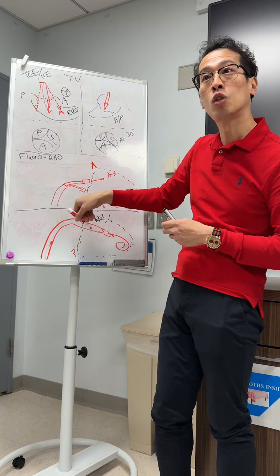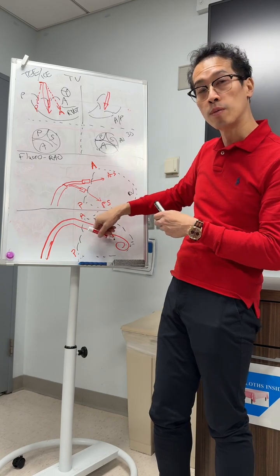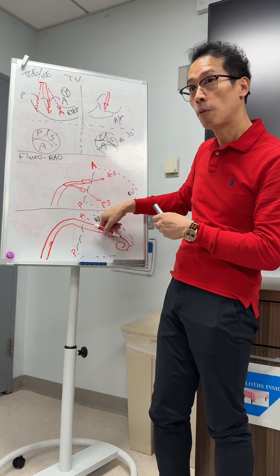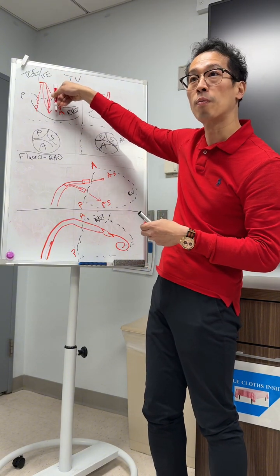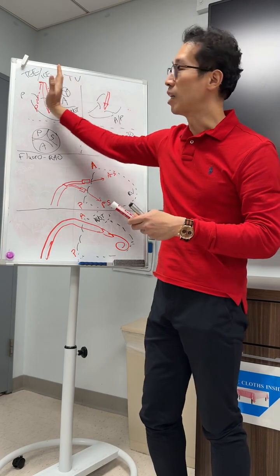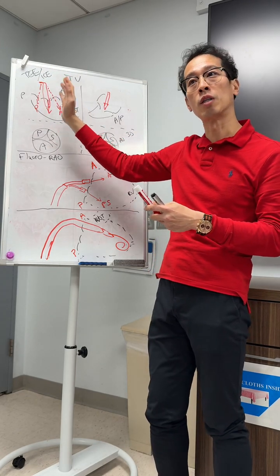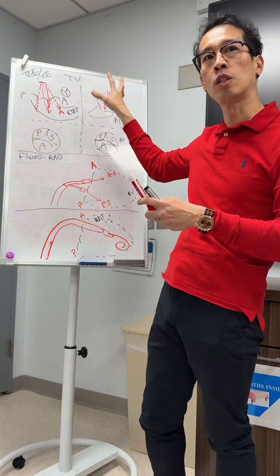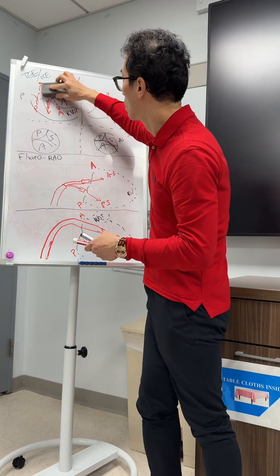And if you flex it too much, you unflex. You can see the wire bending. You can also naturally adjust the wire. Same thing here. If you unflex, you'll stand up. Now, the other thing that we didn't say, that's just angulation. What about translation? We haven't even talked about translation. We'll talk about a septal hugger last because that's actually the trickiest part to talk about. So let me just talk about this.